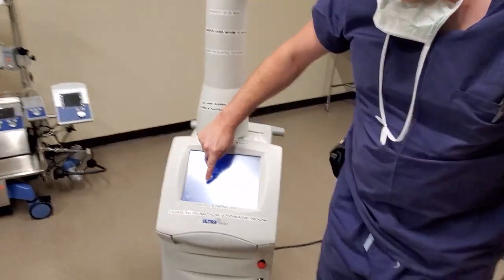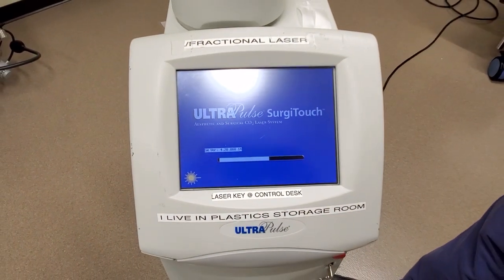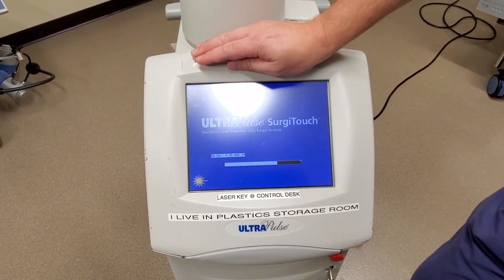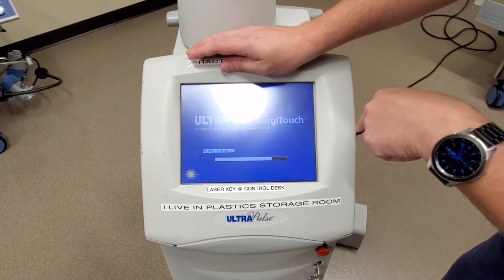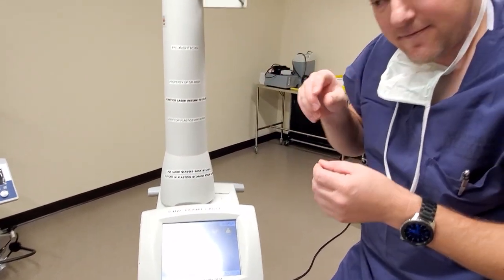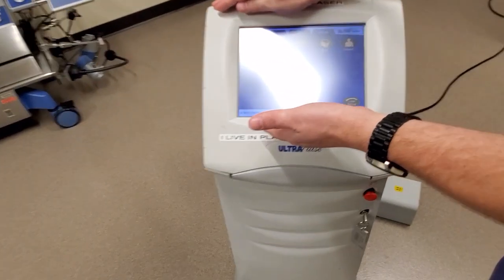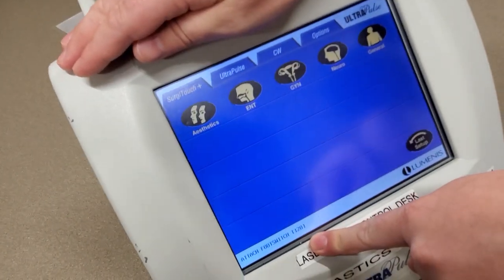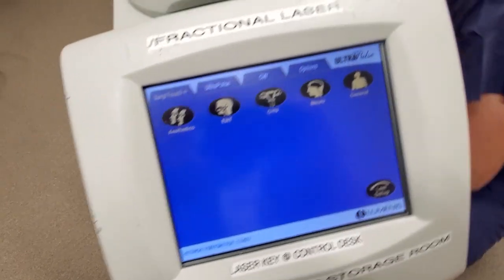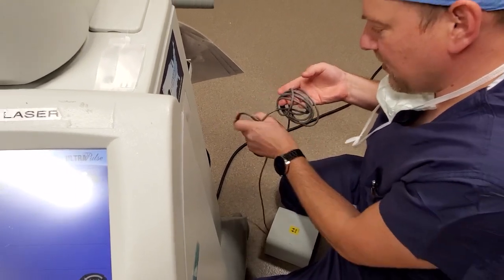When the laser boots up, it's going to give you the software version, which is going to be very important. It is a touch screen. There's going to be a variety of options when the laser boots up. You can hear it do an energy test internally — that's the different tones you hear. It's different powers and frequencies that it vibrates the laser beam at. It is completely booted up. I have one error code right there — it's saying to attach the foot switch. I'm going to go ahead and attach the foot switch. The foot switch is the only item you can connect while the laser is powered up.